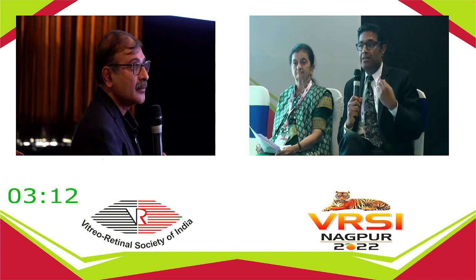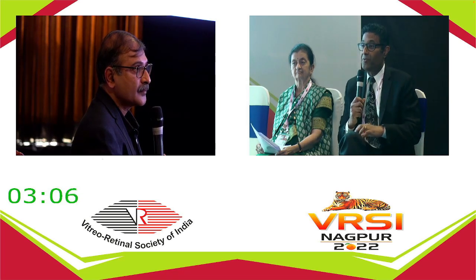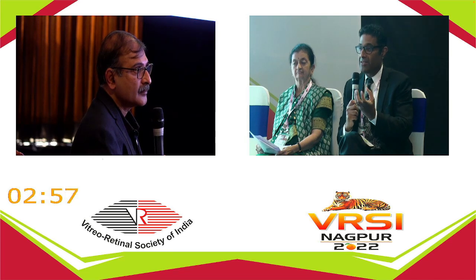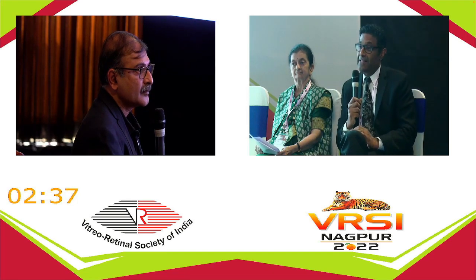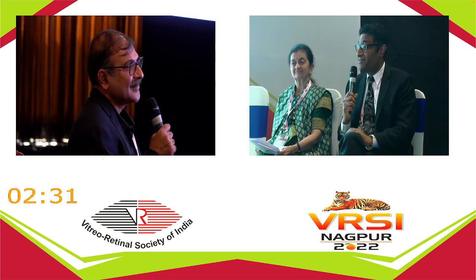Well, that's what I was saying. The way I've done this before, I have to confess, I haven't done this since verteporfin became available. This is sort of pre-verteporfin days. You get pretty rapid clearance, and you're right, you want to maximize your photothrombotic effect. So the idea is you have this big coiled loop or a bunch of vessels there. If you have active infusion, you'll have a fair amount of ICGA concentration, and then you light it up with a long wavelength, a diode laser, something like that. That's how I used to do it. Maybe somebody can do a better job of answering that question. I feel like I haven't answered it properly.